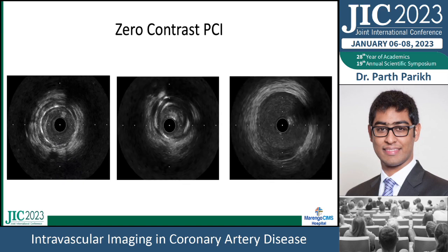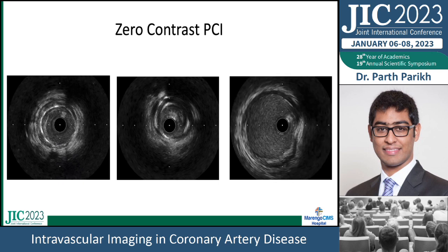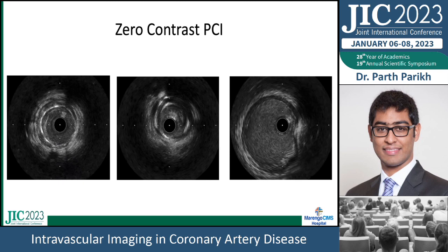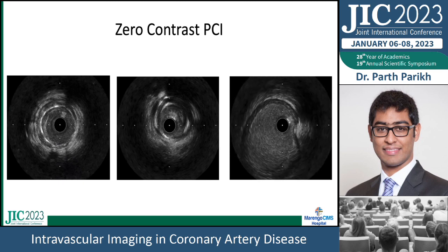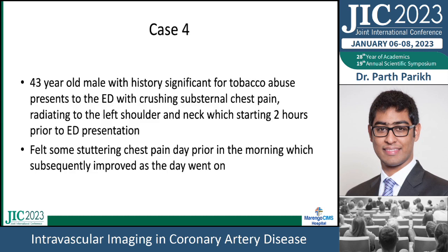So again, this is probably one of the most important things that is upcoming as well, where interventional cardiologists should start becoming comfortable doing PCIs with absolutely zero contrast if they are able to get access to the right imaging tools in the right patient, as long as we have diagnostic images.